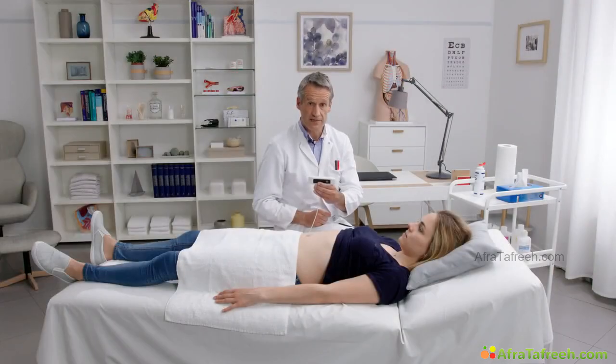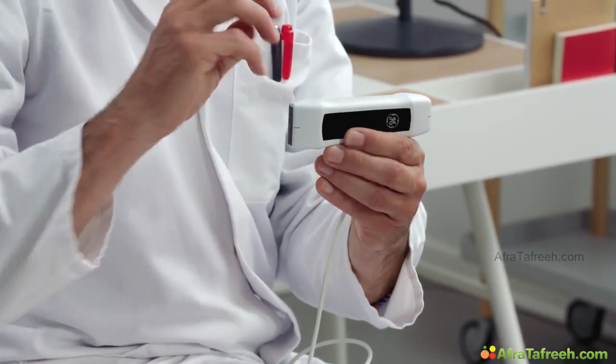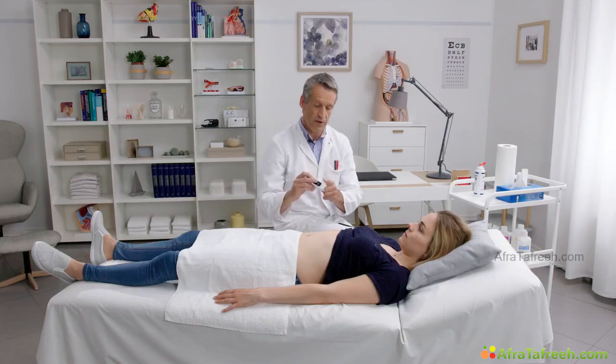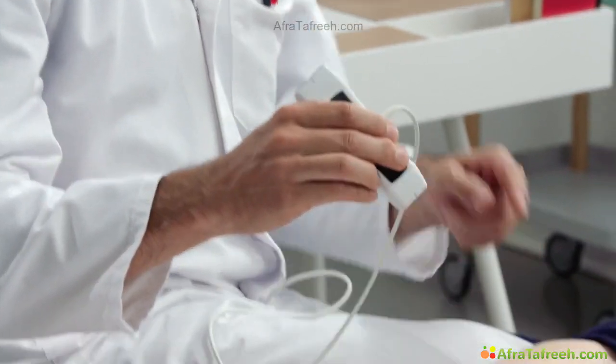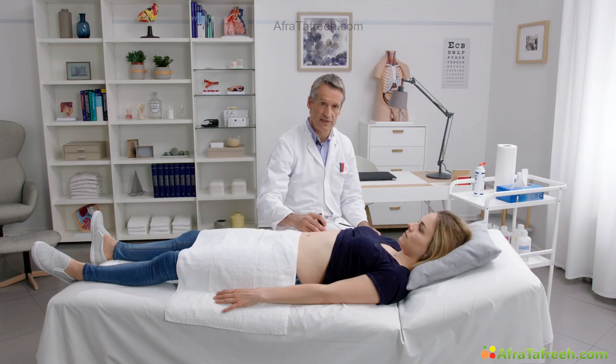For imaging the kidneys in the primary care ultrasound setting, we are using this primary care ultrasound device equipped with a dual probe. A linear probe on one side and a phased array probe on the other side. We are using the phased array probe for imaging the kidney, and this notch on the probe shows us the cranial direction when scanning the kidney longitudinally.